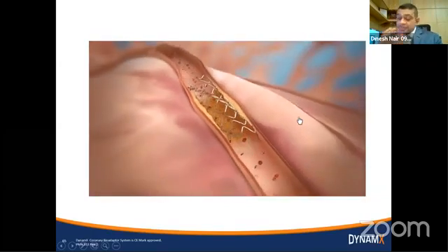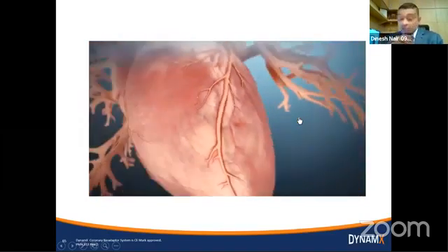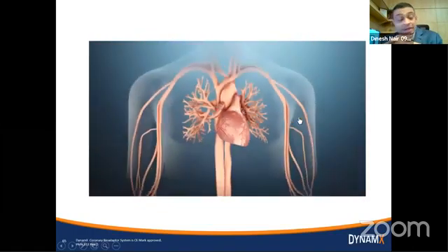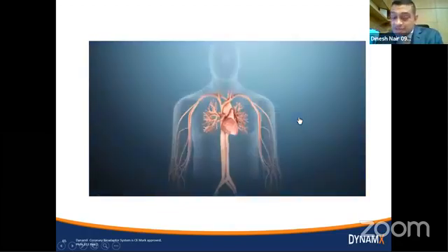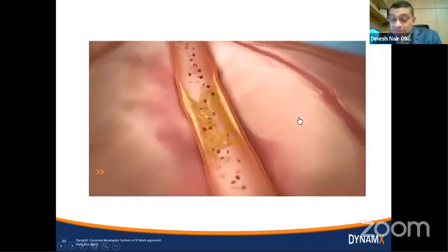So I'm hoping that these few technologies I've shared with you have been of some interest. There's a lot more we could go through. The bioabsorbable stents, we've been using quite a lot of that. I've been making extensive use of drug-eluting balloons, just balloons that elute drug without putting a cage in. All these technologies combined reduce the amount of metal we have to put in for patients, and in doing so, improve outcomes for them as well.